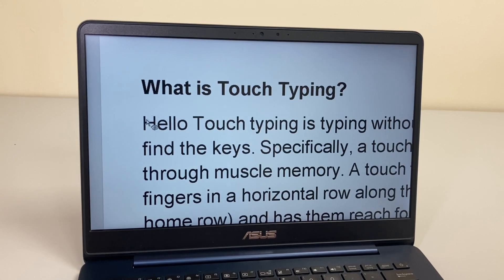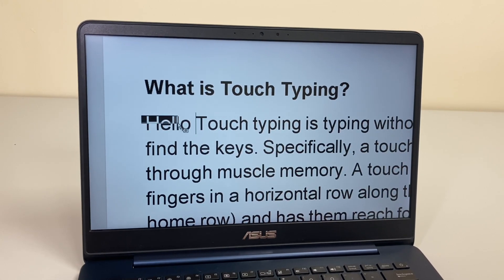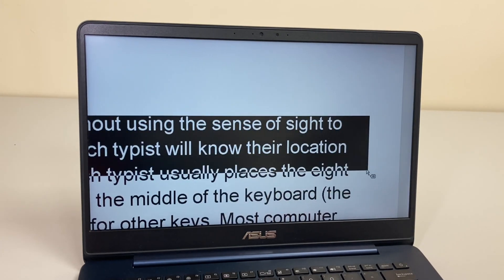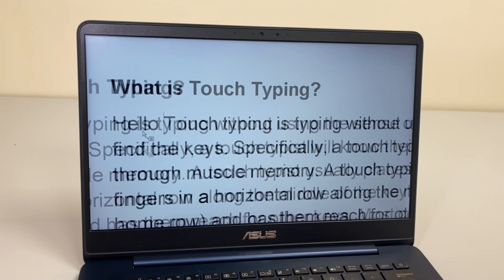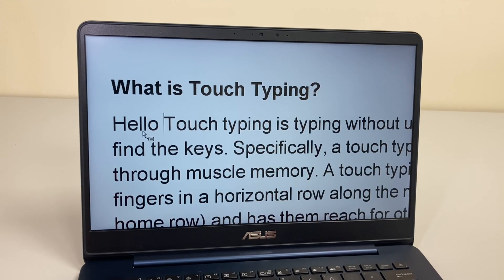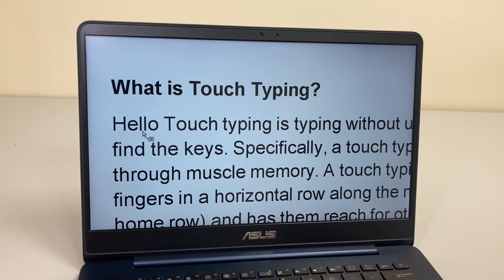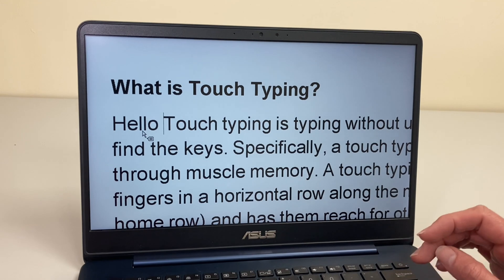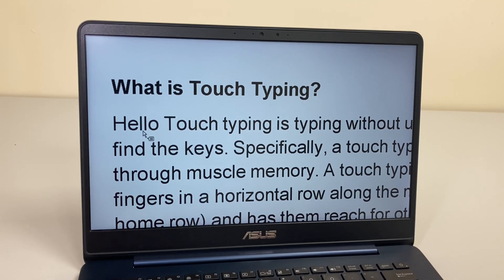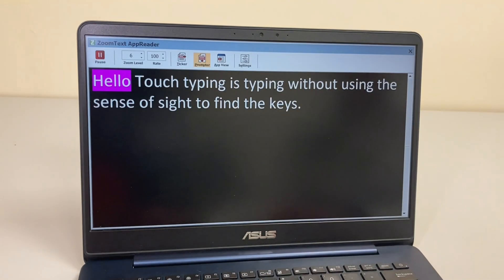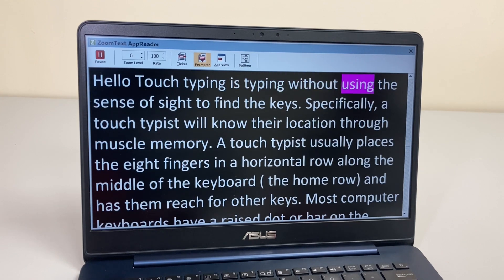The Speak It Tool lets you select something you want to read. So I can basically select some text, and it reads: 'Touch typing is typing without using the sense of sight to find the keys. Specifically, a touch typist will know their location through muscle memory.' It just reads what I highlighted there.